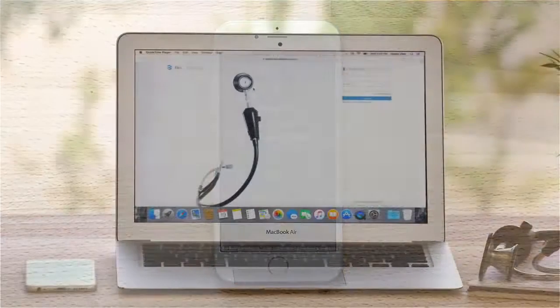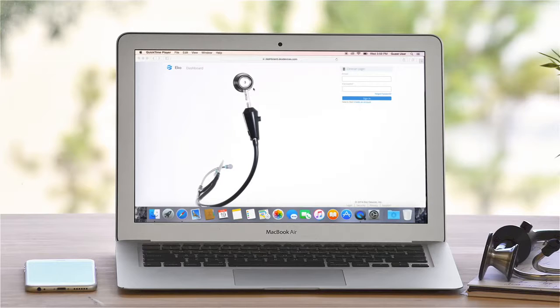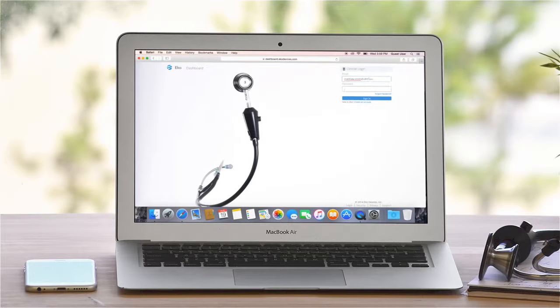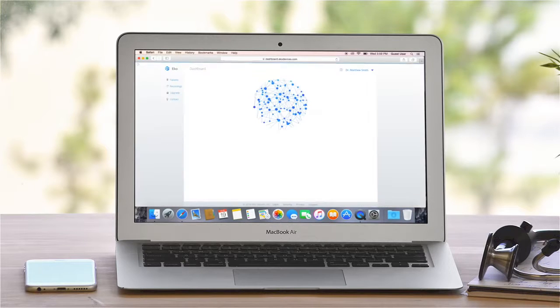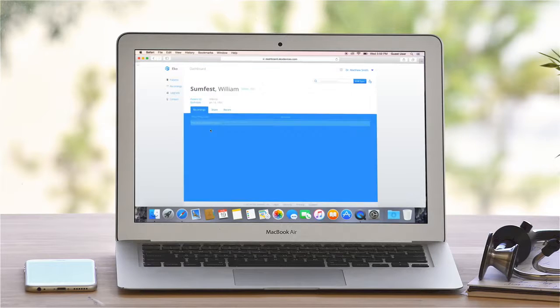Now we'll move on to demonstrate the Eko web dashboard. Authorized clinicians can log in at any time to play back pre-recorded heart sounds. Enter your credentials and the home page for the dashboard will appear.